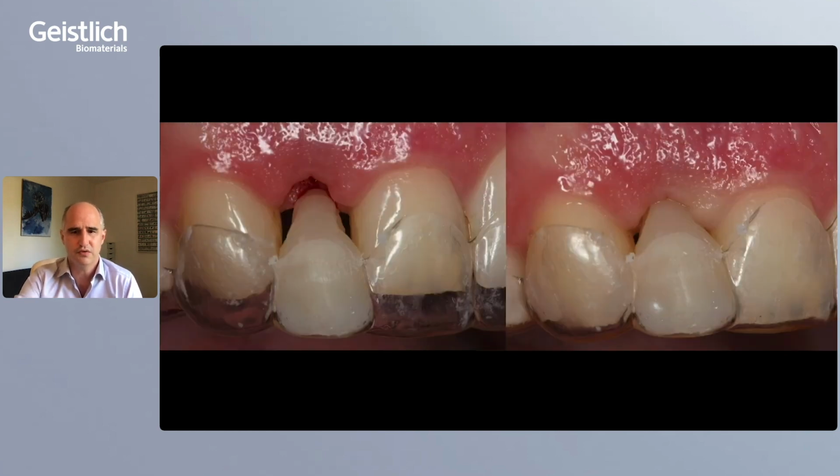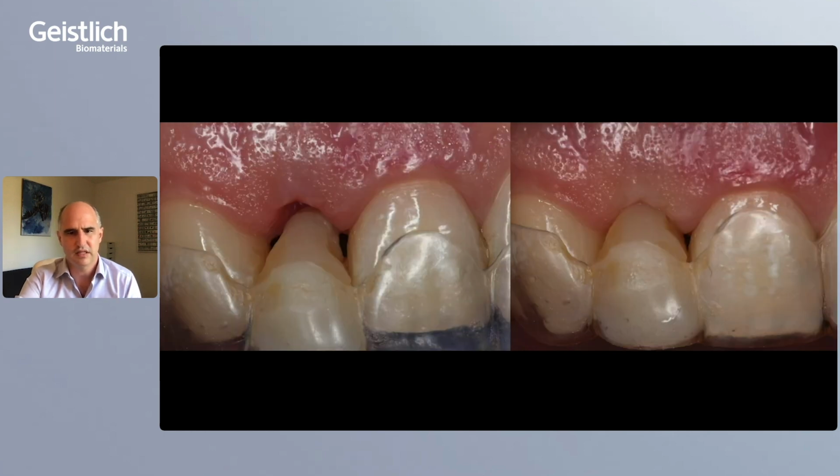In cases where I use resin bonded bridges, I immediately start to sculpt my pontic. In this case, I started with an Essex retainer and added some pressure on the subgingival areas to push the situation to the buccal side, to the palatal side, and also to the interproximal side. I do this over many appointments in order to achieve a nice pontic result.